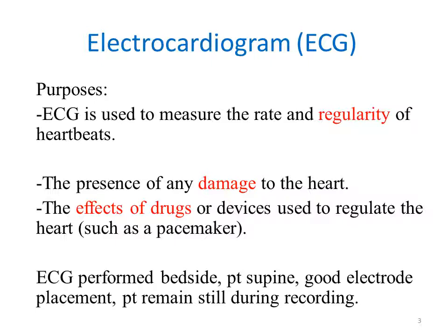The ECG can be performed bedside, with the patient in supine position. We have to have a good electrode placement and the patient remains still during recording, which means that the patient should be constant, ثابت, مستقر, no movement, and remove any metallic material during recording the ECG.